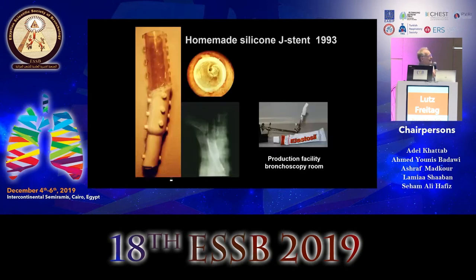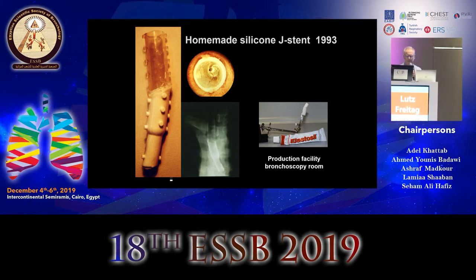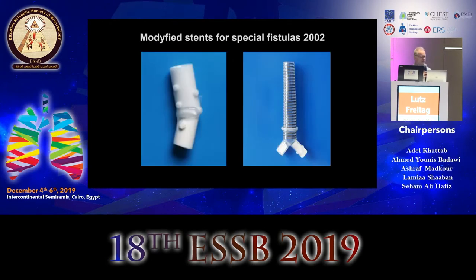In those days, this was 1993, I did many things that, let me say, once made me famous and would get me into jail today. What I did was take some stents and glue them together. The material was from Home Depot. In those days it was relatively easy. Now, legal hurdles are just too big.